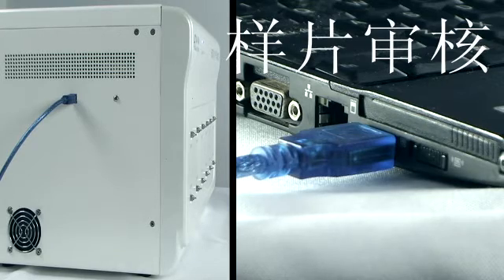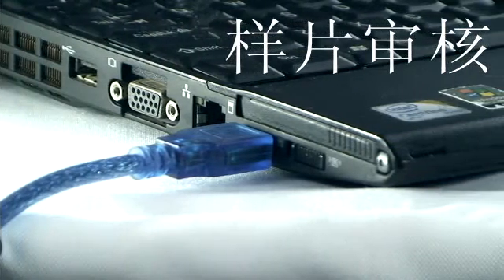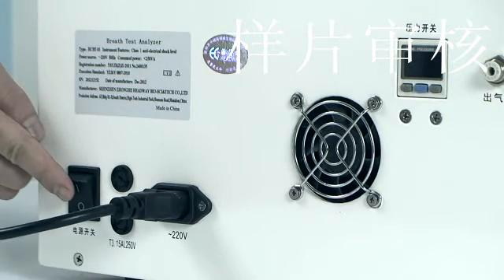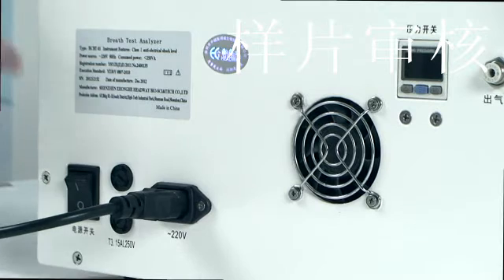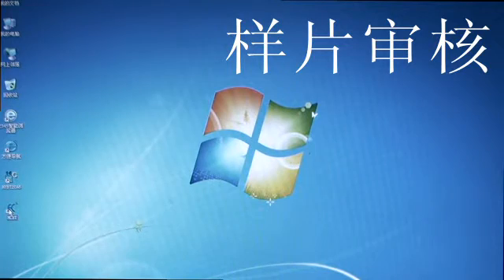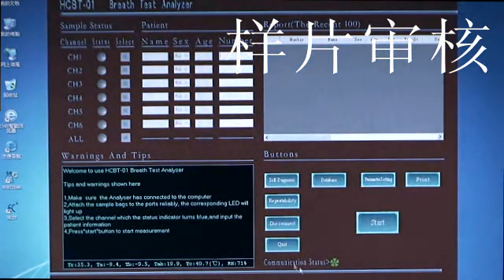To start the instrument: connect the instrument mainframe to the operating computer using the USB communication cable. Turn on the user computer, then turn on the power switch of the instrument mainframe. Click the shortcut icon on the desktop or click '13C infrared spectrum meter' in the program menu bar to start the procedure. When the procedure starts, the main interface will appear. Click the Spectrum Meter Connection button on the program main interface to establish communication between the computer and instrument mainframe, so the instrument can be controlled through the software.